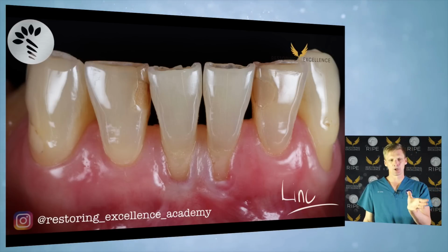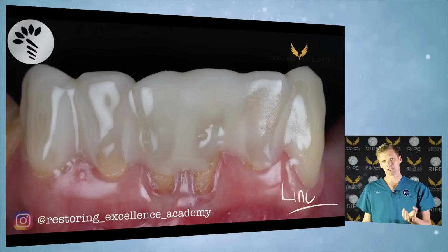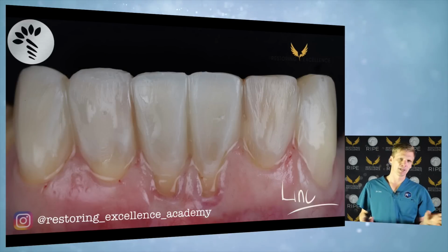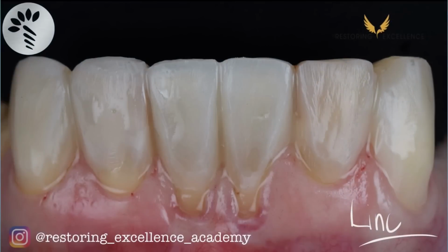So now we go through, this is the mock-up. That was just a mock-up because this particular patient was too small a case to bother getting a wax up. I can do a mock-up like this in 10 minutes, so it's easier. And if a dentist says 10 minutes, what does he actually mean? Probably 20, okay? We always say 10 minutes faster than we really are. So I did a mock-up in this case. It's basically like my wax up.